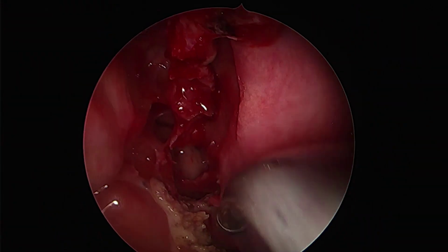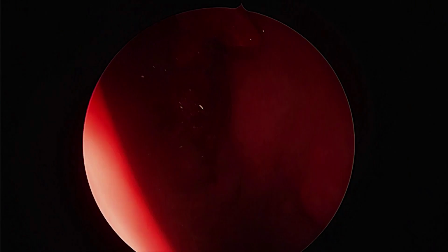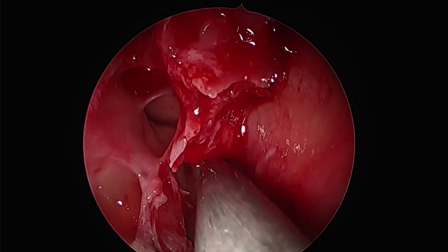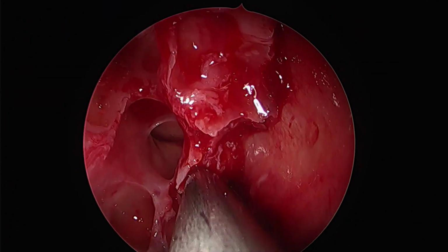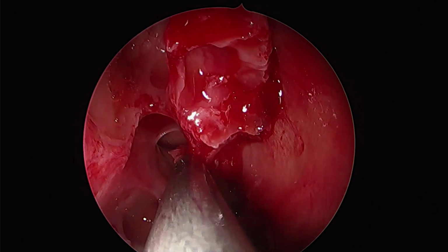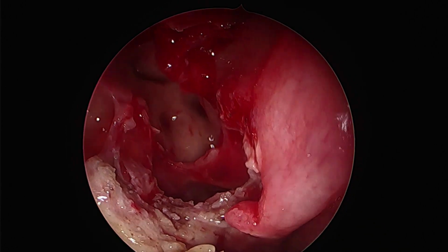Once we have reduced that soft tissue, we can see it's a far better field for us, and the sphenoid has been opened rather widely, showcasing the septation of the Onodi. The rest of the septations are now being taken off, and now this looks into a complete ethmoidal cavity.